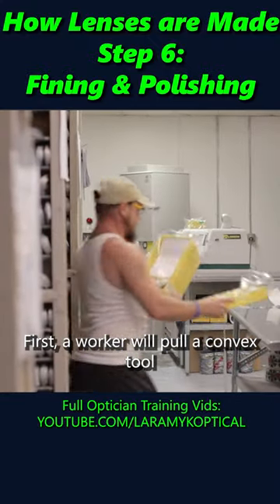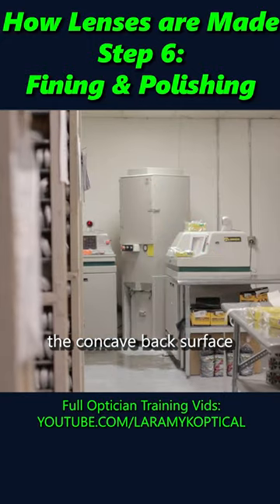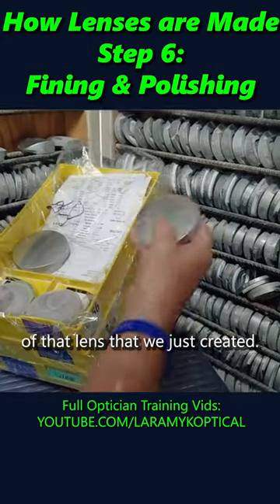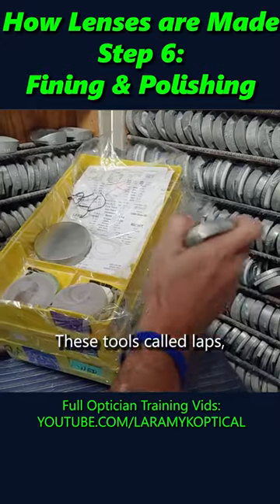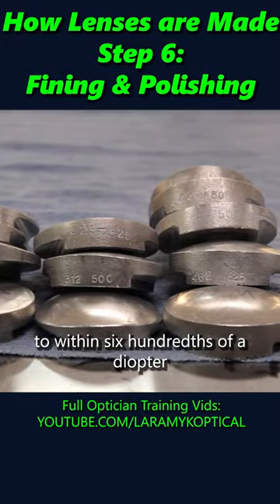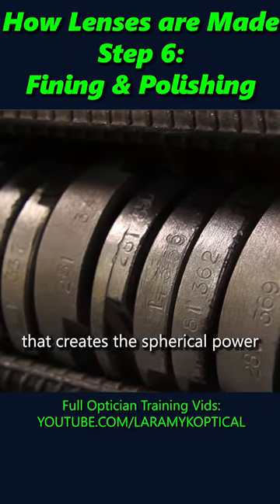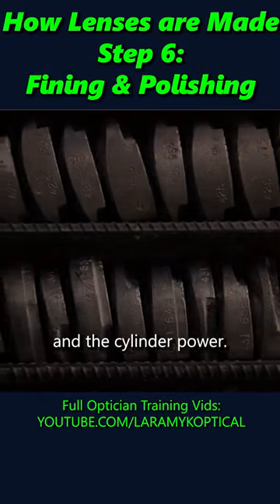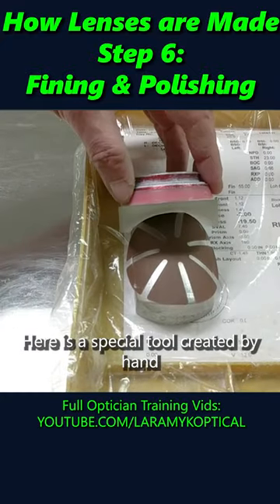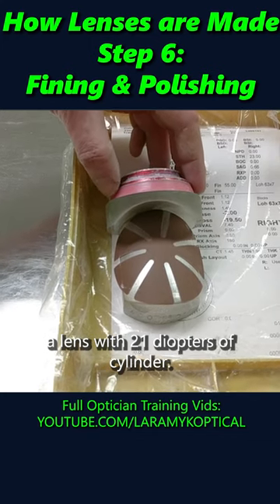First, a worker will pull a convex tool that will perfectly match the concave back surface of the lens that we just created. These tools, called laps, which are accurate to within six hundredths of a diopter, need to match the curve that creates the spherical power and the cylinder power. Here is a special tool created by hand to fine and polish a lens with 21 diopters of cylinder.